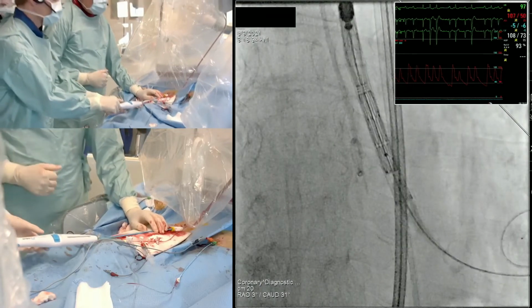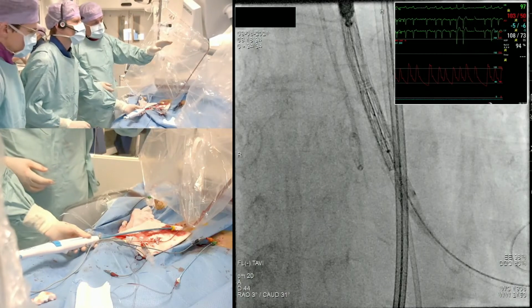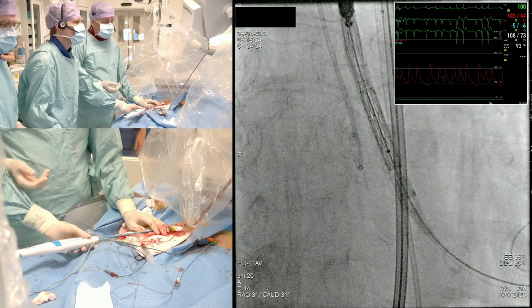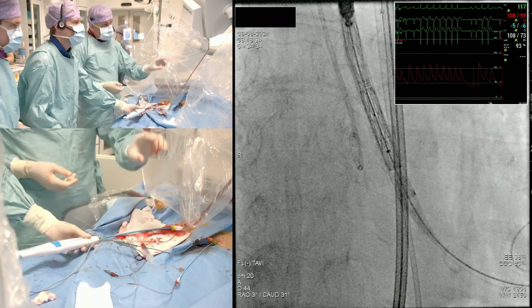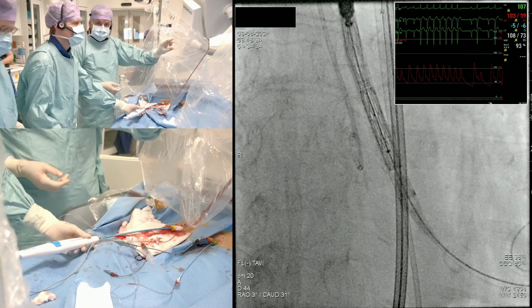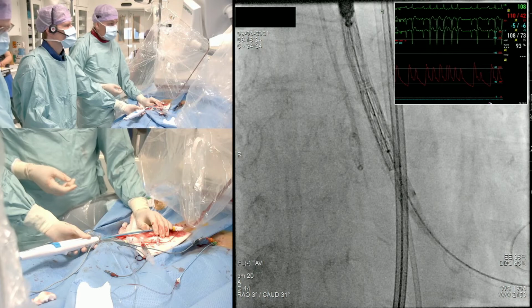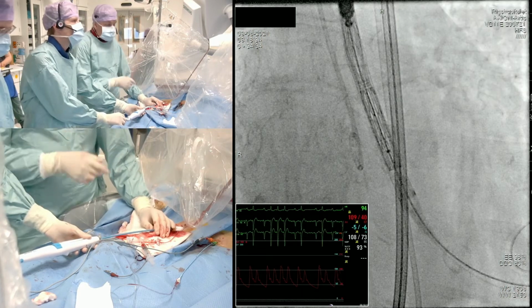As we see here, the advantage is that you're going to have often no parallax in your delivery system and still have the 3 aortic cusps aligned, which is of course going to give you a better understanding of how deep you are with your implant. Furthermore, you're going to elongate the left ventricular outflow tract, so you have a more one-to-one understanding of the depth of your implant.